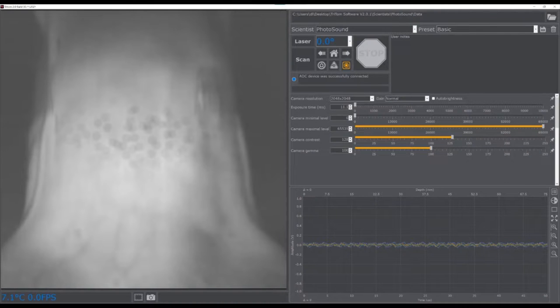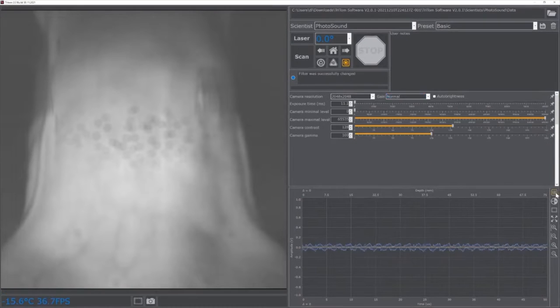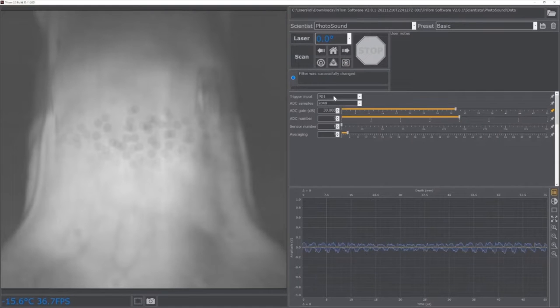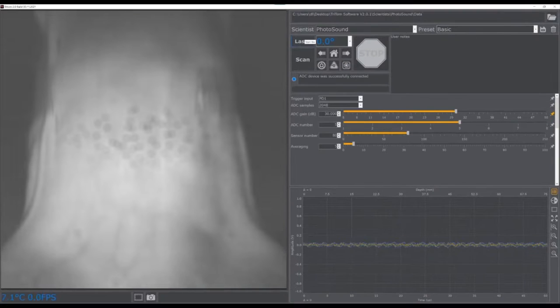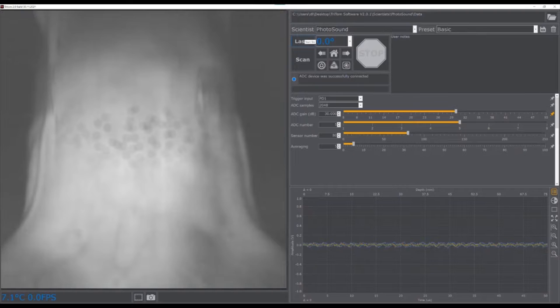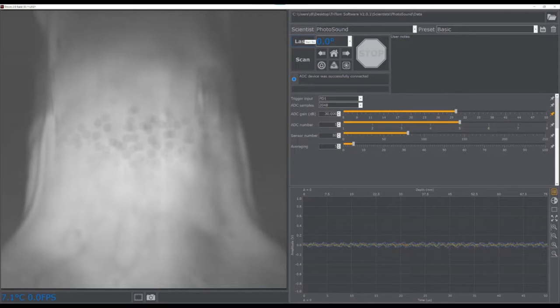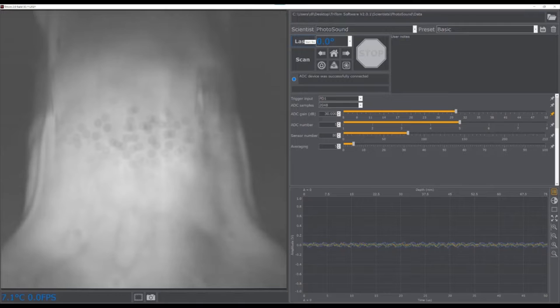Finally, to the right of the photoacoustic viewer plot is the photoacoustic viewer settings menu that contains the trigger input option, ADC gain, and the options for the ADC number and sensors number displayed on the photoacoustic viewer.